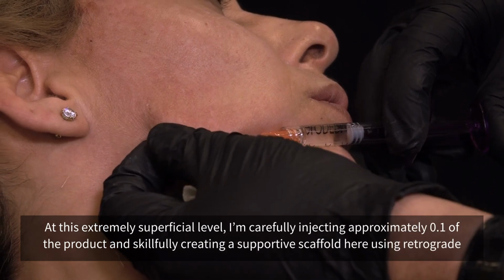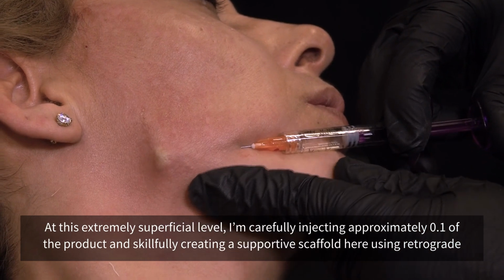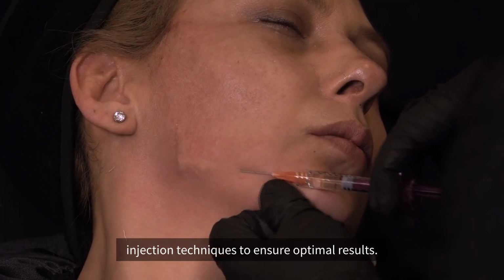At this extremely superficial level, I'm carefully injecting approximately 0.1 of the product and creating a supportive scaffold here using retrograde injection techniques to ensure optimal results.